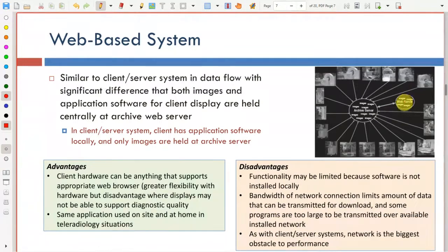Sometimes, if it's a small hospital, then this would be connected to a consultant. They hire a consultant and they send him the difficult cases, or send him the diagnostic reports from the young doctors or the residents, so that he can confirm them. So having a web server would allow the connections, instead of just having the connections inside the hospital with the hospital network only.